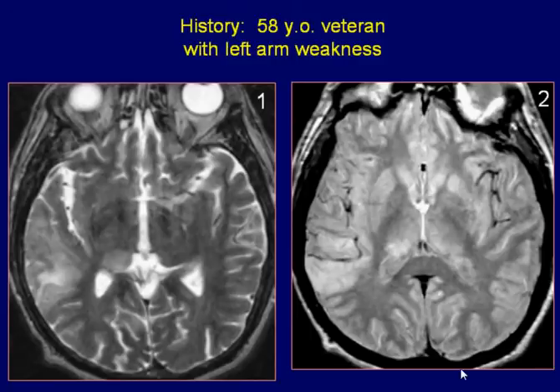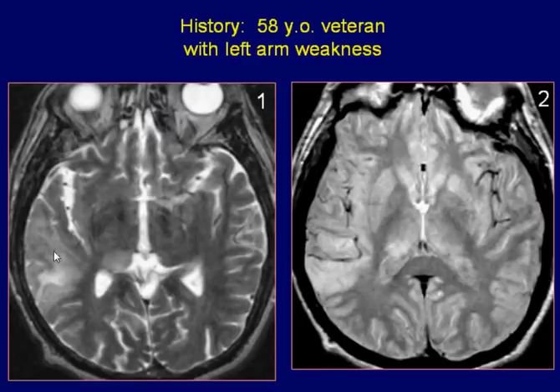A 58-year-old veteran with left arm weakness. Axial T2 and proton density-weighted images of the brain reveal a hyper-intense lesion in the region of the right temporal lobe with involvement of both gray and white matter. A mild degree of mass effect is present. Another subtle hyper-intensity is noted in the right posterior thalamus.